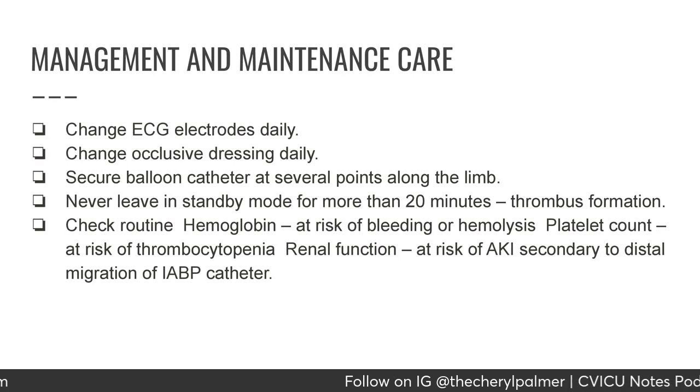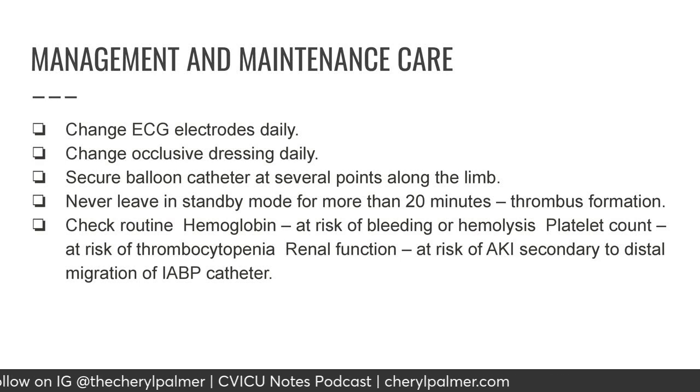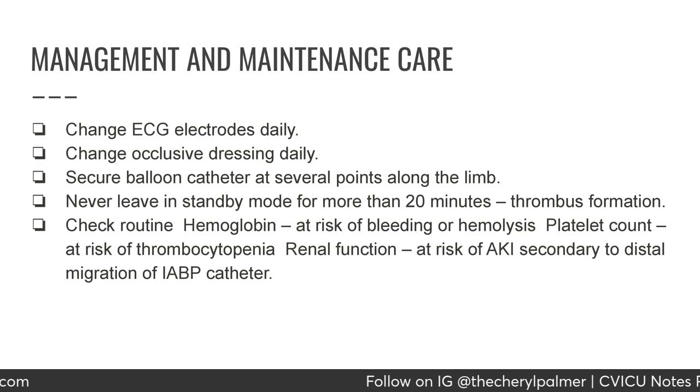Check a routine hemoglobin. The patients are at risk for bleeding or hemolysis. Check the platelet count. They are at risk for thrombocytopenia. Check the renal function. They're at risk for AKI secondary to the distal migration of the balloon pump catheter.